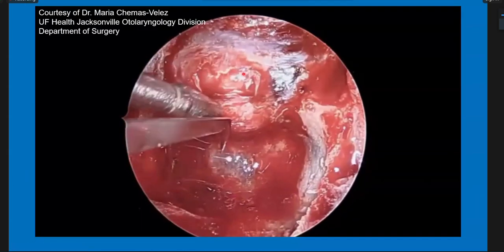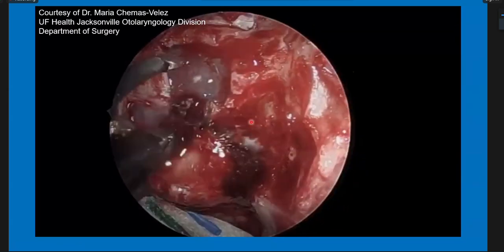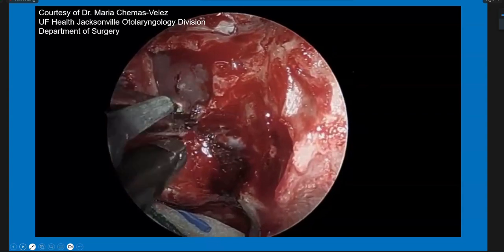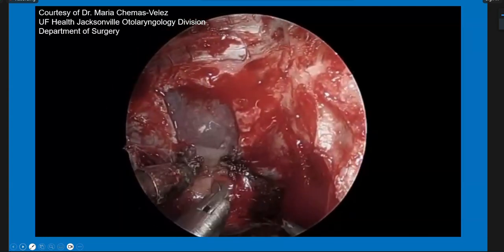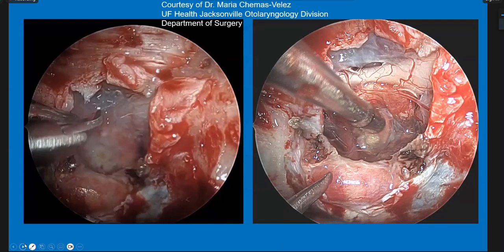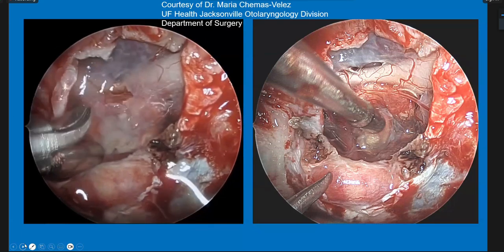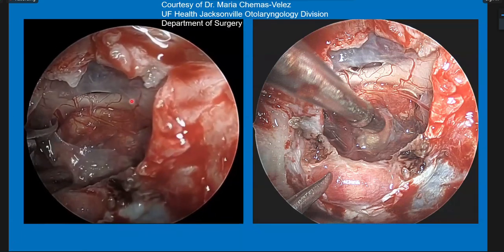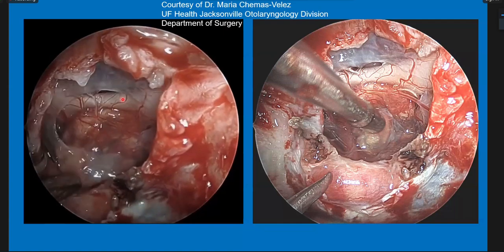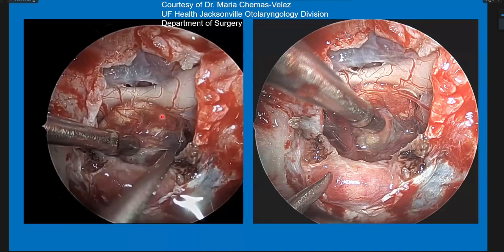And here you have an endoscopic video. This is the intro video opening of the dura. So this is where they're working on. This is the area of the pituitary. And you can see here the optic chiasm. And they're trying to deliver the mass.